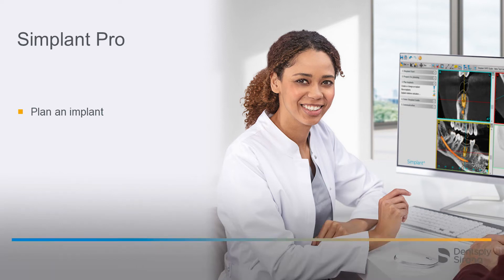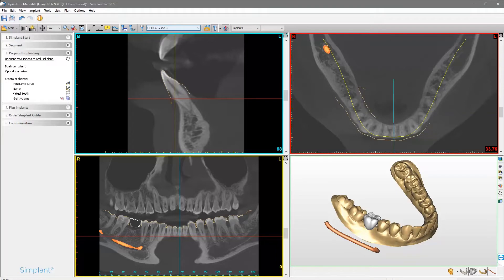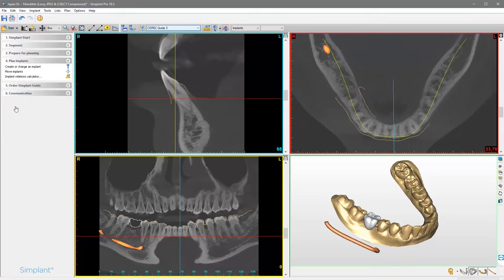Welcome to this video tutorial on the topic of Simplant Pro. First, we switch to the step Plan Implants and activate the option Create or Change an Implant.